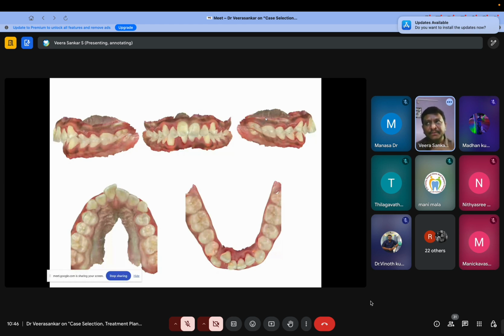In those cases, when it comes to braces or an orthopedic or myofunctional appliance, what we will do is something called a pre-functional appliance, wherein we will bond the entire anteriors, even if it is a mixed dentition case. We will correct the inclination of the incisors so as to create sufficient overjet for the mandible to come forward. We will actually assess whether it is happening on its own or whether we need to guide the mandible forward with the help of any other appliances.